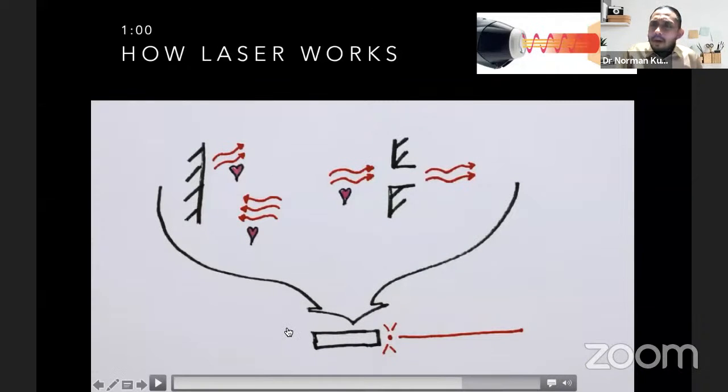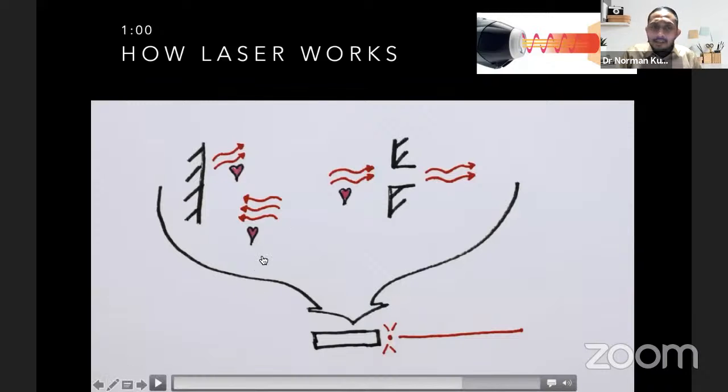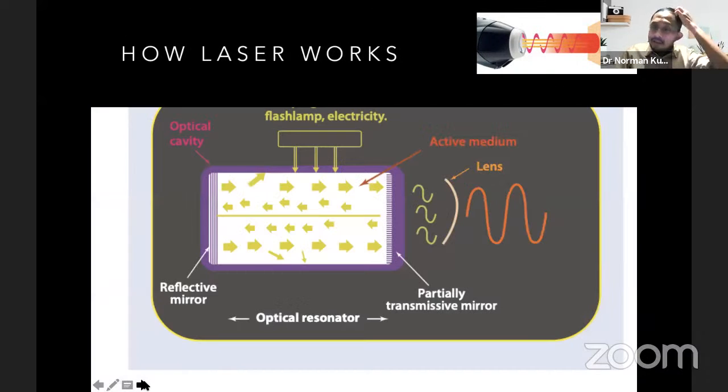So why is Dr. Norman always mentioning the same physical interaction? Because in my opinion, right now, laser is really easy and adaptable to all of the soft tissue and all of the treatment. And you already have the programming in the laser. So when you want to choose frenectomy, you just choose frenectomy. Gingivectomy, you just choose gingivectomy on the manufacturer's laser.